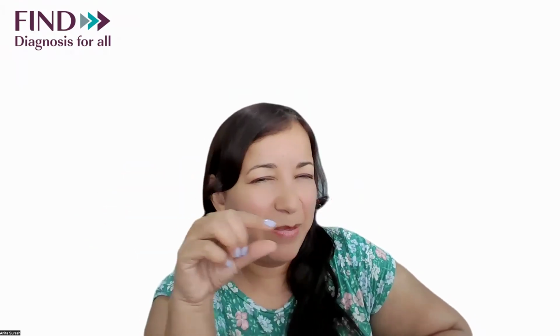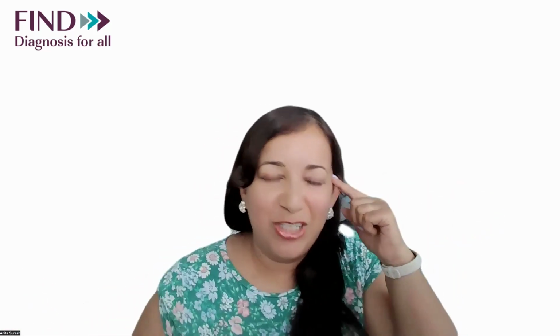Okay. And yeah, that's really hard to cover. A PCR test cannot cover it because it could be mutations in any of that entire gene.